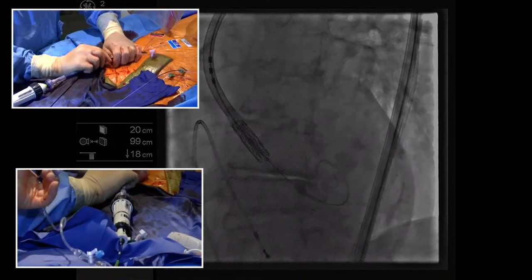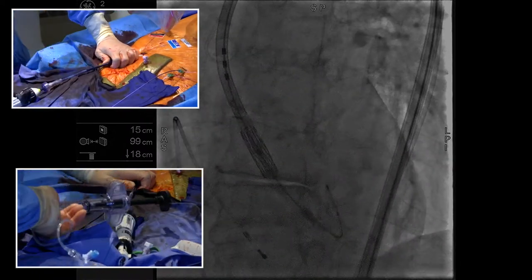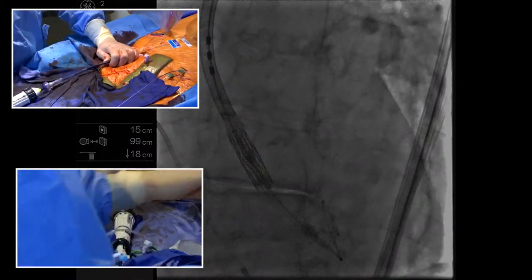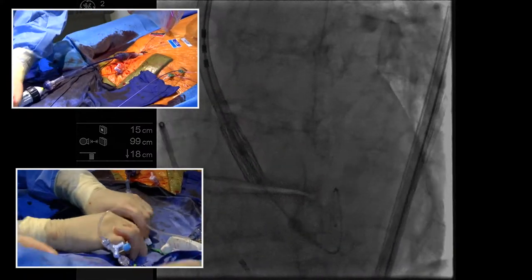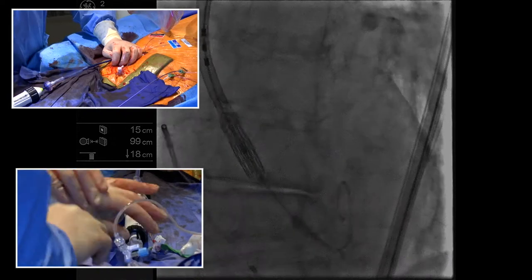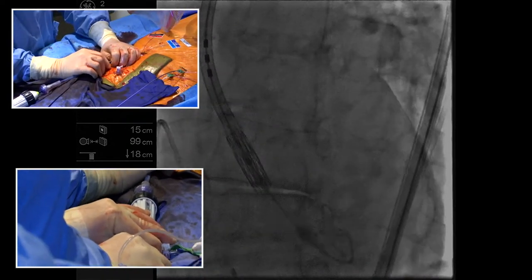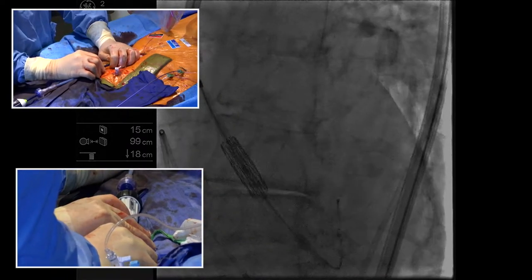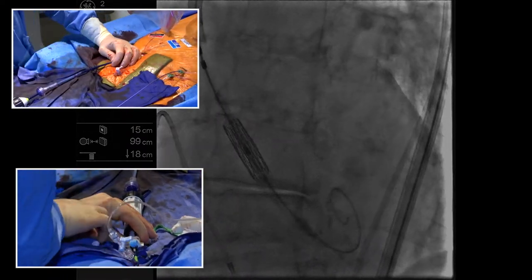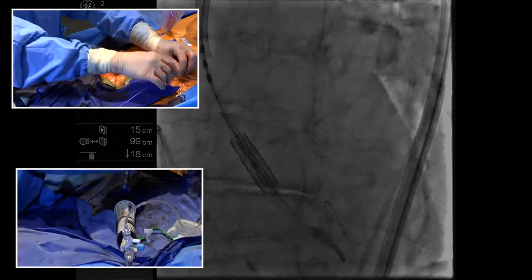It was a little hard to cross, but not too bad. Okay, I'm gonna mag it up to two. Now why don't you push her back. I'll hold the sheath for you. Keep the valve where it is, and with your right hand, move your left hand to your right hand. You have to break the seal. There you go, right to there. Perfect. Stop right there, and then we tighten it back up again. Lock it all the way. Good. Okay, now we're ready to deploy the valve.